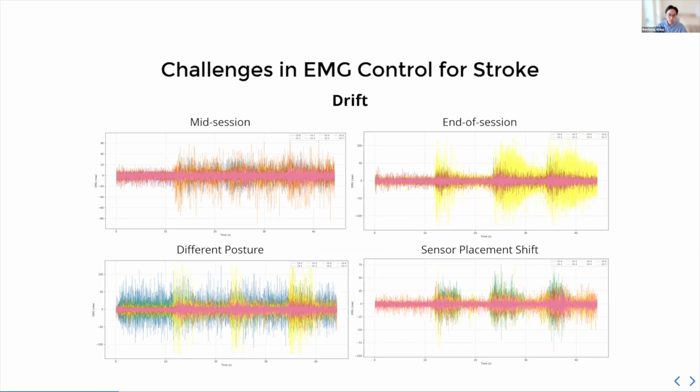People have different body mass, muscle mass, body fat, hair, and it also changes when you go to a different position, when you place the sensor slightly differently, when you're fatigued. All of that comes into account. And in stroke, the difference is even wider due to the nature of their injury and how they recover.